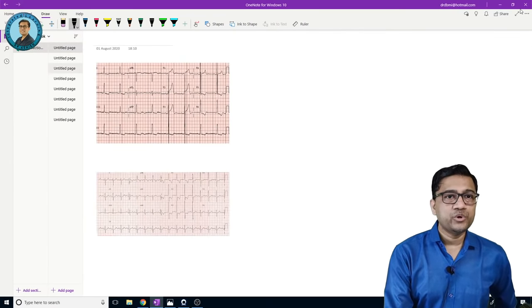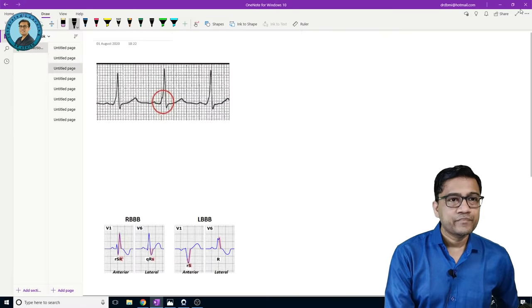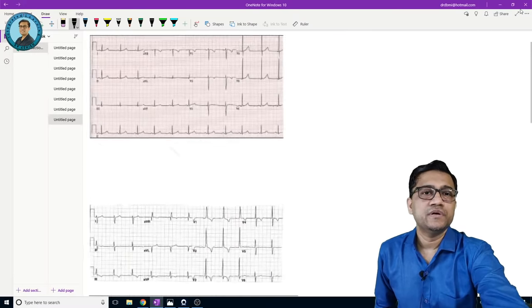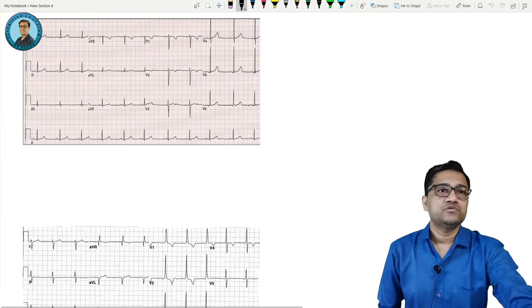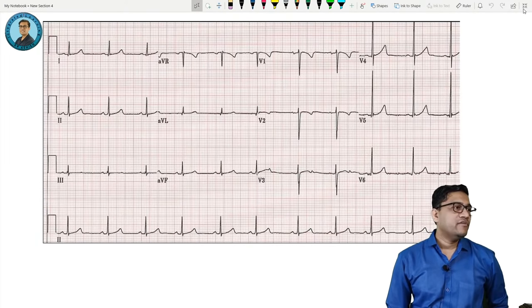Okay. So I'll show you and you tell me. I'll start. So please see this. And what do you see here? Where is lead 2 biggest?